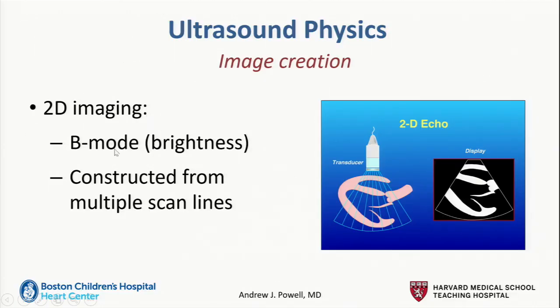And then there's 2D imaging. This is sometimes called B mode, and here the B stands for brightness. Here now you have a diagram of what's going on in order to make a 2D image. So what it does is it draws the image sector by sector or line by line, starting at one edge and moving across to the other. So it draws this line really quickly, almost like a single M mode line, and then it does this one, and it does it sequentially.